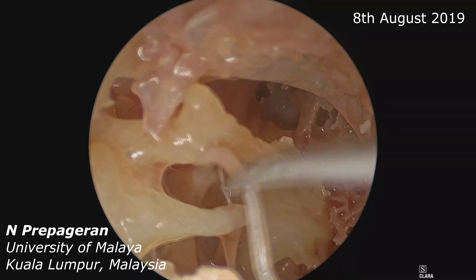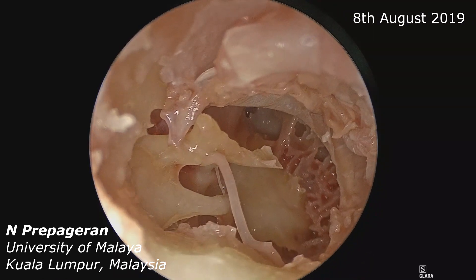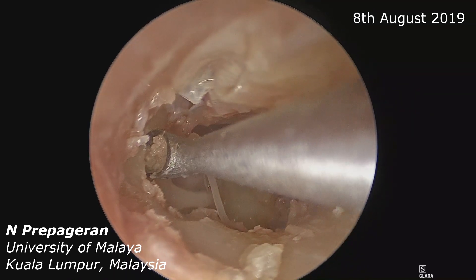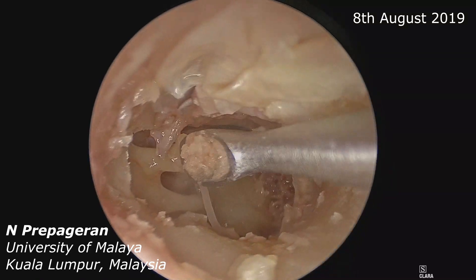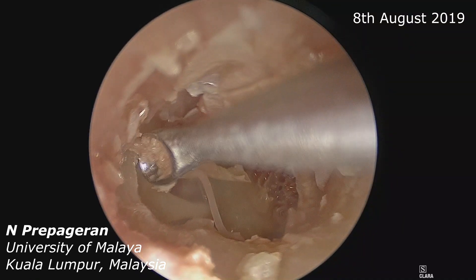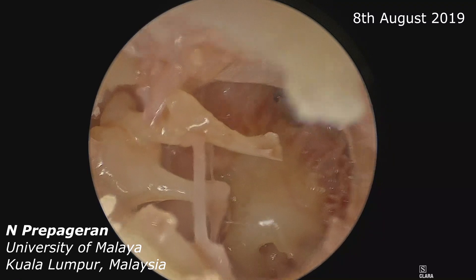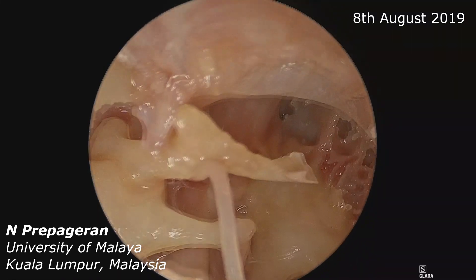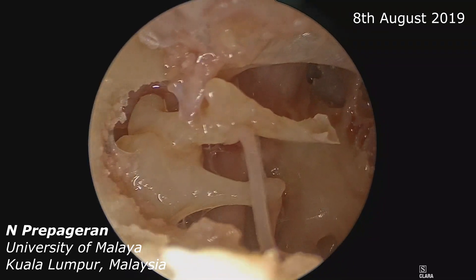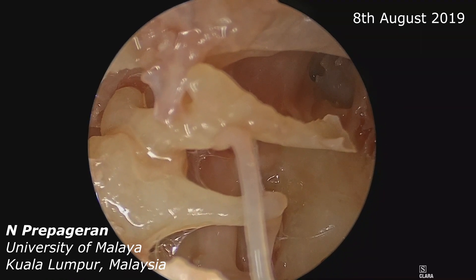And that is the facial nerve down here. Let me try to curette a bit more — if we curette more, we should be able to see the head better. Whenever you are curetteing, make sure your scope is at a respectful distance from the curette itself — don't get too close or you will hit the scope. You can just about make out the head of the malleus, the superior mallear fold, the head of the incus, the superior incudal ligament, and the facial nerve very nicely.